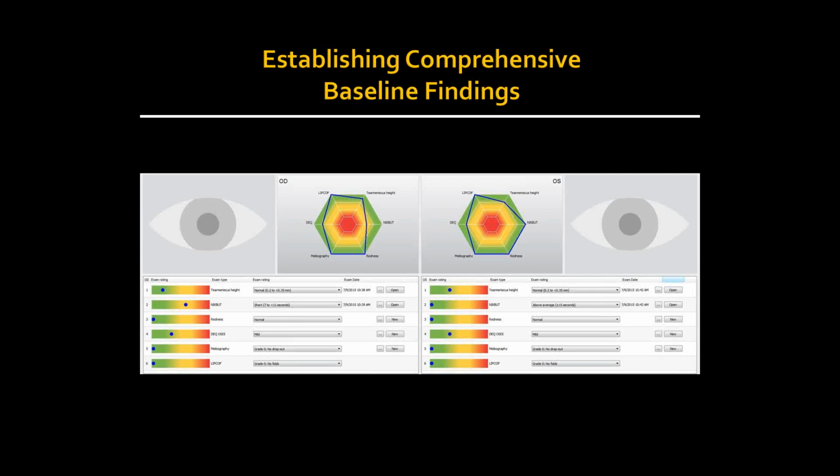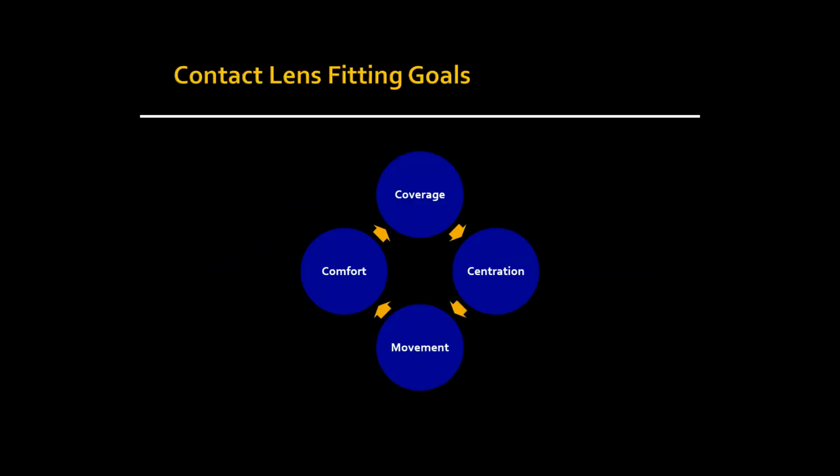Now, this is getting a big picture of the factors that affect the environment and understanding whether or not you want to treat a patient. So say you determine that this patient is a great candidate for contact lenses. You now want to go into fitting the contact lenses.